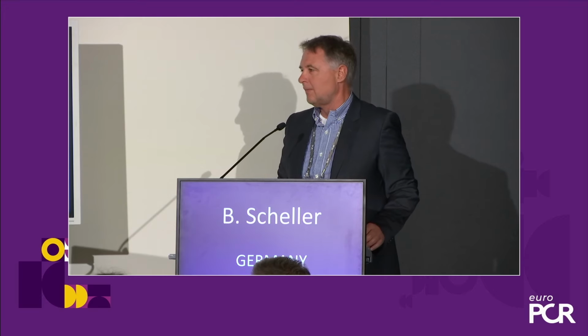Thank you, Bruno. I think that this summarized very well the basis on which we have been discussing. I will not be showing the slides, but 3 concepts are those you have to take home. There is nothing like direct DCB. It's like putting direct stent in a calcified lesion. Prepare, prepare, prepare, and then if preparation is good, you go with DCB. There are no contraindications. There are no lesions that cannot be considered.